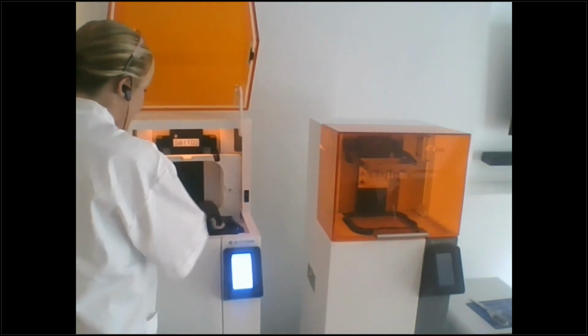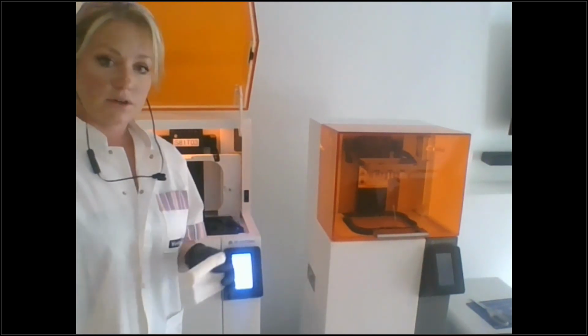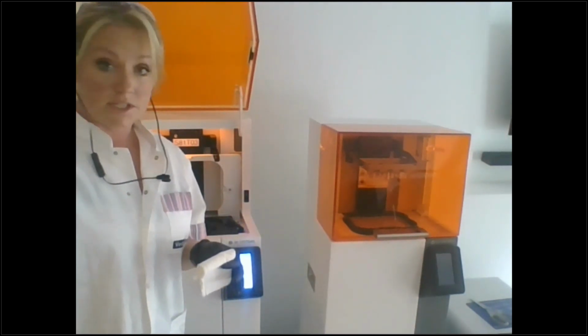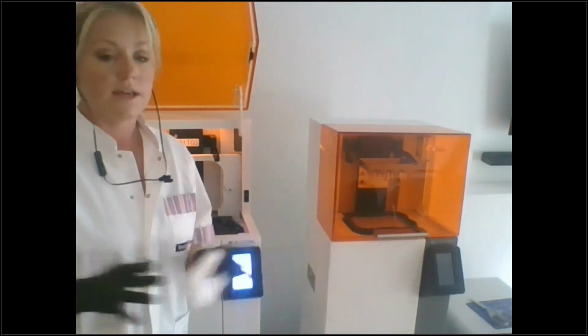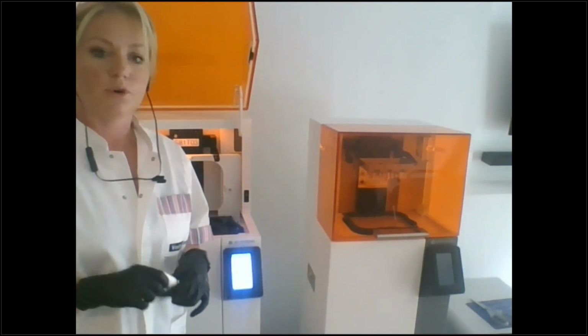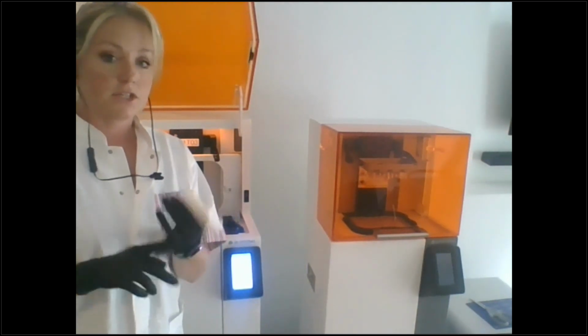And sometimes when you're taking out your tray, you might spill a little resin and then it gets cured on there and then you add a little bit of stress and so then you get a tear and you don't want to do that because the membrane will last you a year or two if you take care of it properly. So it's really important that I showed you don't remove supports.